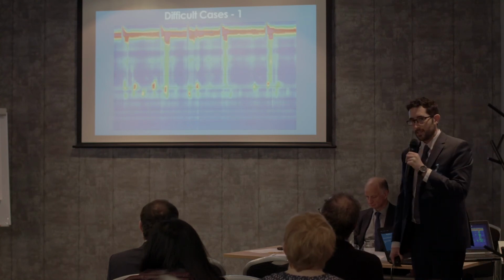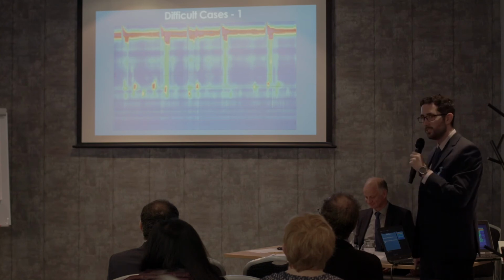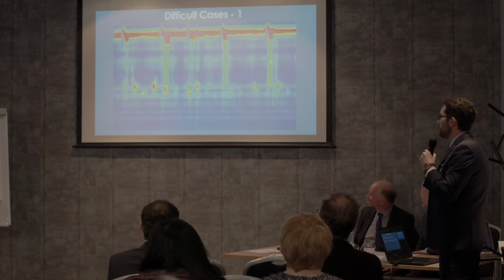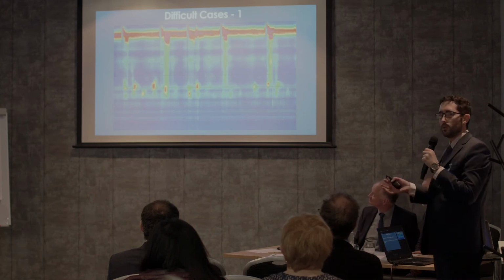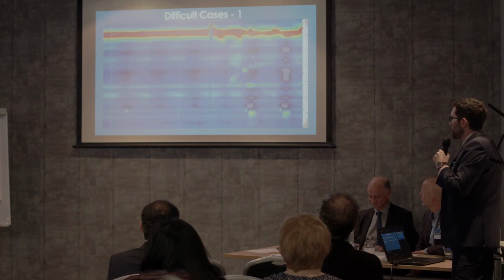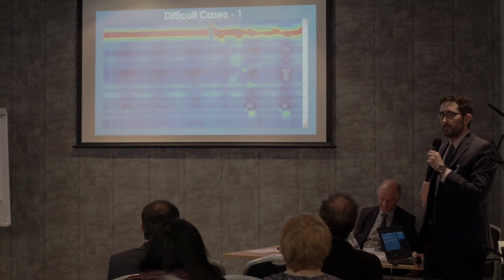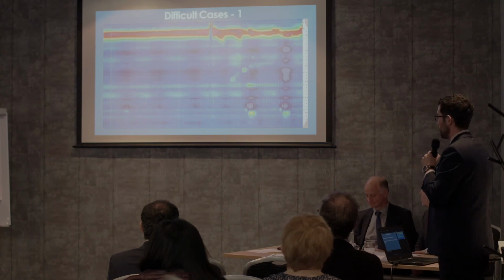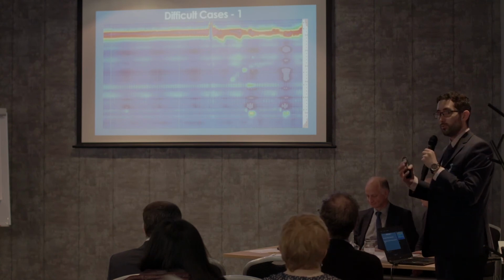So that's when I panic. Is this the lungs? Have I intubated a guide dog by mistake? No features of the normal anatomy, I'm wondering where I am. But start from the first principles. You've got to remember that if you've taken a history and they have had a myotomy 10 years ago and they've had multiple dilatations, you're probably not going to see any of the normal features.